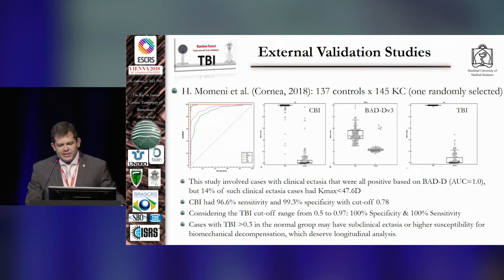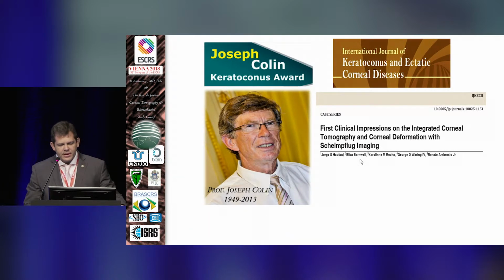And you see, even with the tomography, that you have a good separation. You see here much more separation. It gives us the understanding that even with the ROC curve that is almost perfect, virtually perfect to better say, we have a better separation with the TBI.